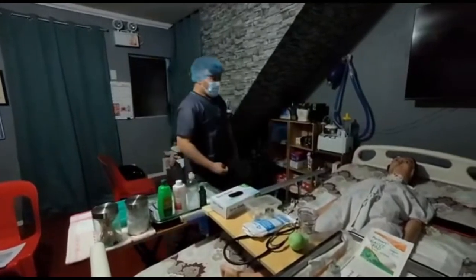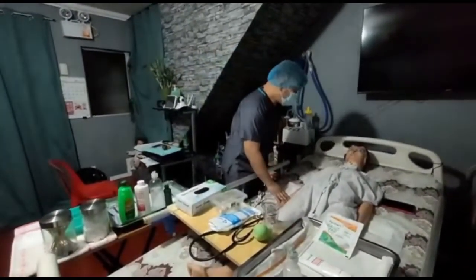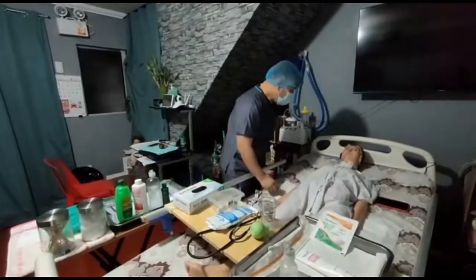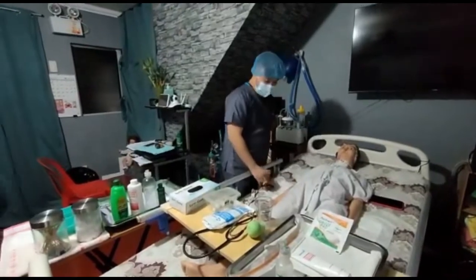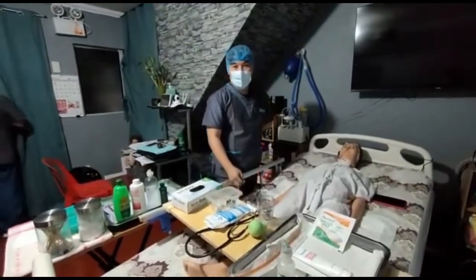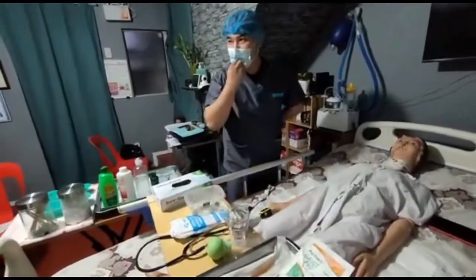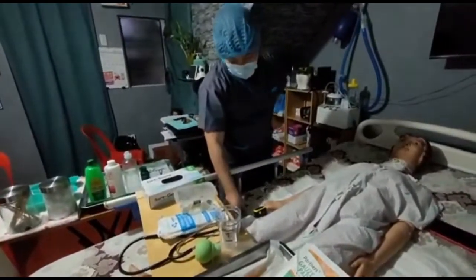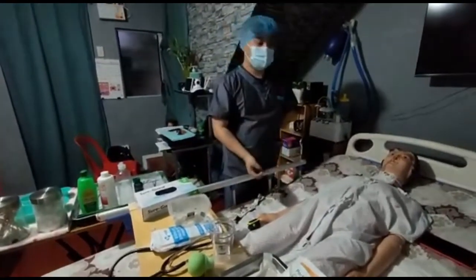So first, magpapakilala tayo kay client. Ayan. So good morning, ma'am. Ako po si Yuro, yung nurse nyo ngayon. So, ma'am, maglilinis po tayo ng trach nyo, ha, kasi medyo madumi na po siya. Ayan. So, thank you po. So, check po muna natin yung pulse oximeter. Since nasa normal range po siya, which is 95 to 100%, okay na po mag-proceed tayo for the cleaning of tracheostomy.